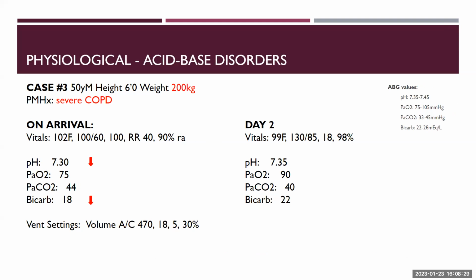So I'll start someone off. Blood pressure or temperature improving, blood pressure improving. Respiratory rate is matching the vent, which is always a positive. They have COPD, but are satting about 98%.